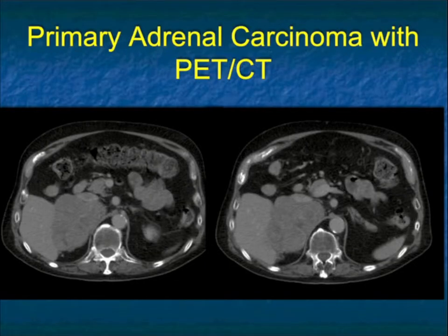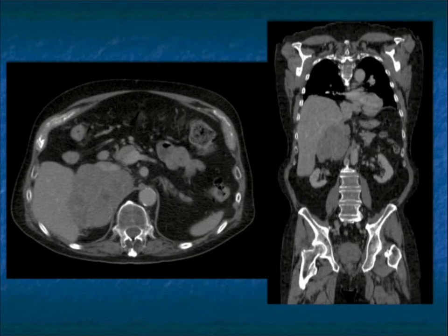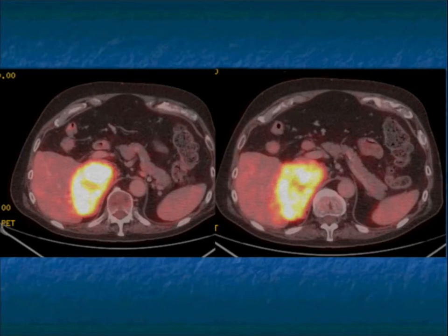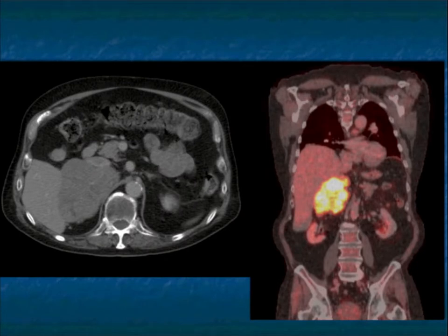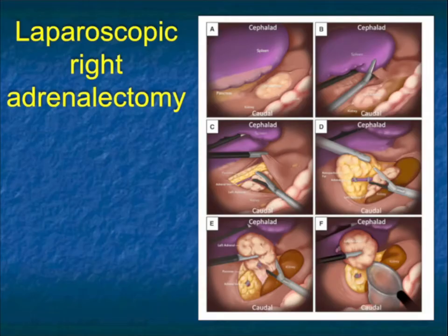PET-CT can be valuable. Here's a case with a large right adrenal mass with irregular borders — there's the coronal, and there's the PET scan. It's not specific for primary adrenal cortical carcinoma; metastasis and even some benign lesions can be PET positive. PET can be valuable looking for distant metastasis. In this case, the tumor was localized to the patient's adrenal gland, though with poor margins — a large tumor typically represents a poor outcome.